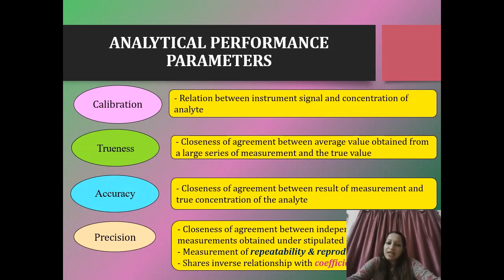First of all, calibration. Calibration is nothing but a relation between the instrument signal and concentration of analyte. Very simply put, it can signify that if a machine gives a particular absorbance, then the concentration of the substance giving that absorbance would be such and such.